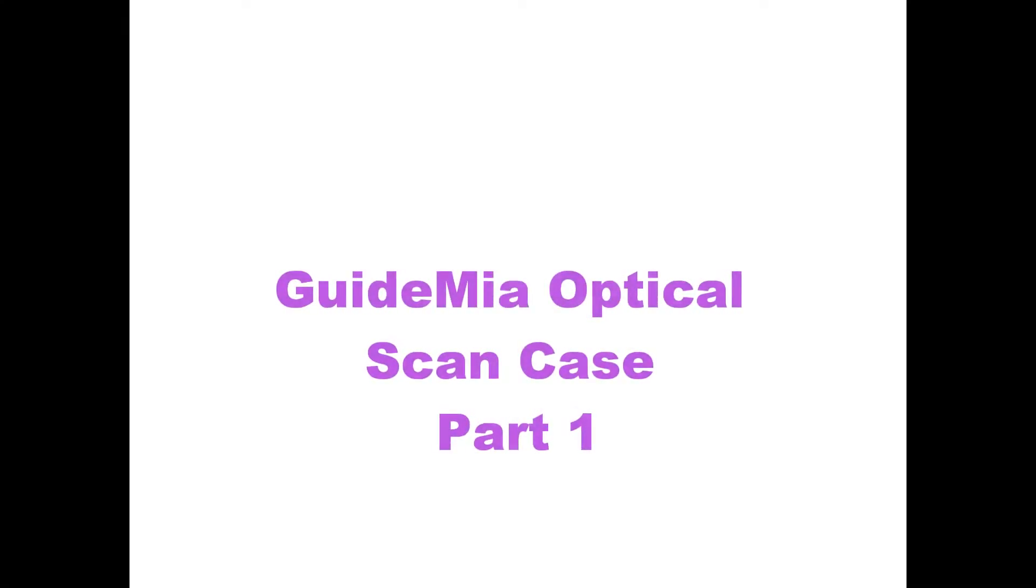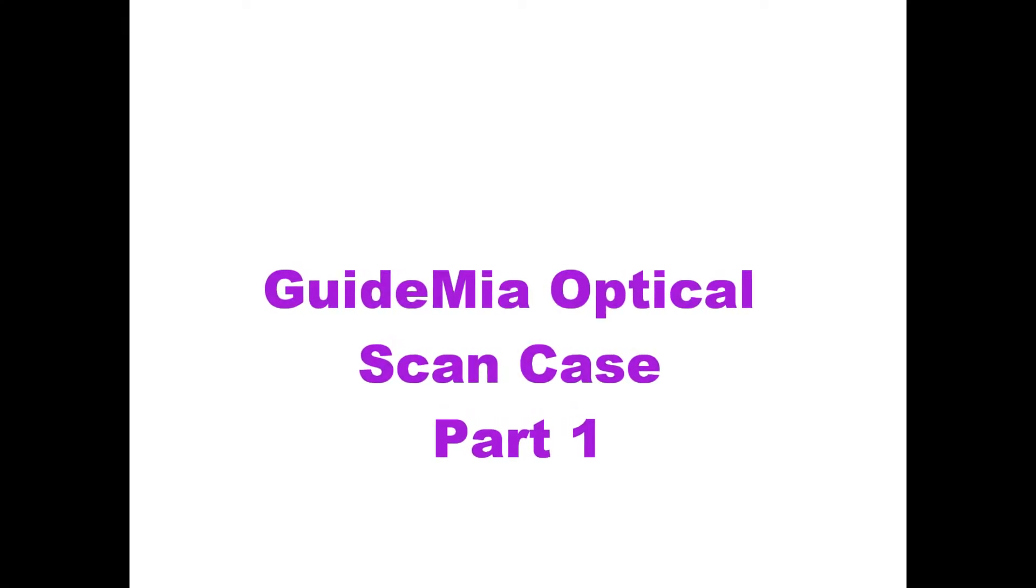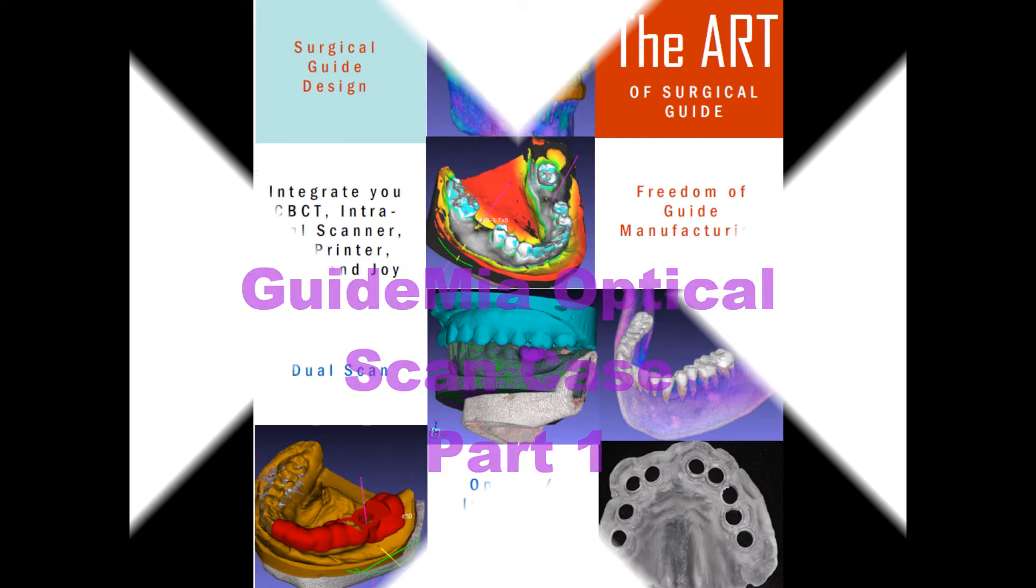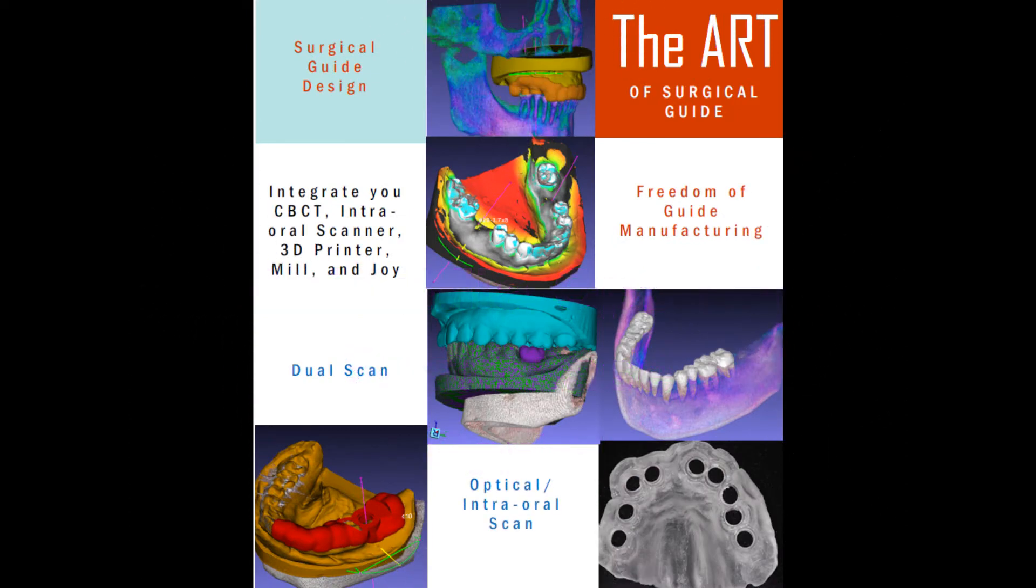Welcome to GuideMeer. In this demo, we will show the basic workflow of dental implant treatment planning using an optical scan of patient's plaster model, or intraoral scan as the base for surgical guide design.